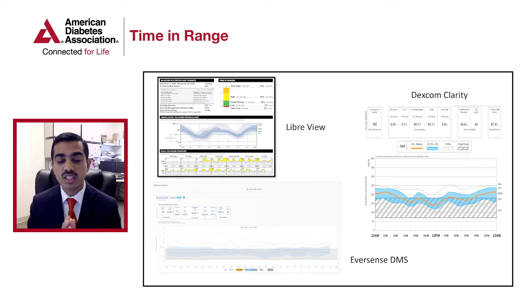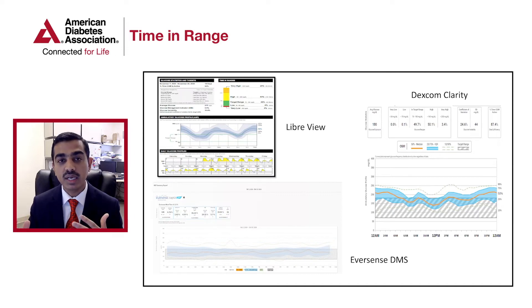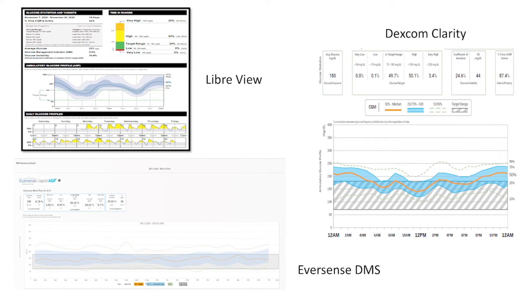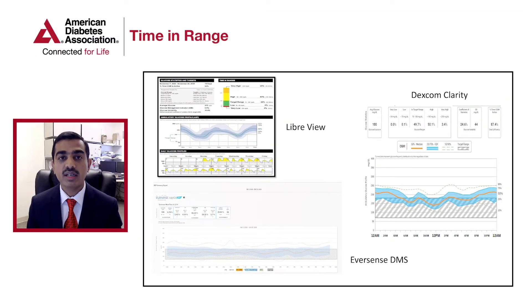You can see here on the screen three different AGP screenshots taken from three different CGM systems. On the top left upper panel is the LibreView from the Abbott FreeStyle Libre. On the right side is the Dexcom Clarity from the Dexcom G6. And at the bottom is the Eversense DMS taken from the Eversense Senseonics CGM. Nowadays, all these glucose meters and CGMs have a standardized way of reporting glucose data through the AGP.